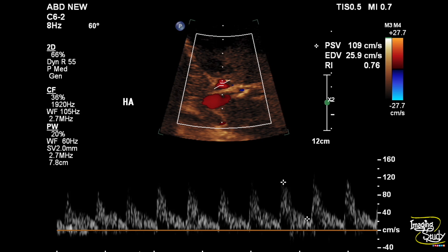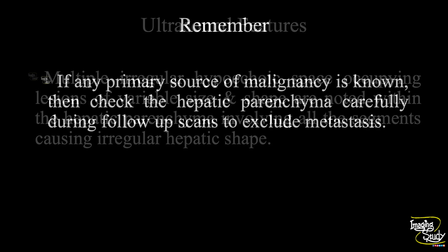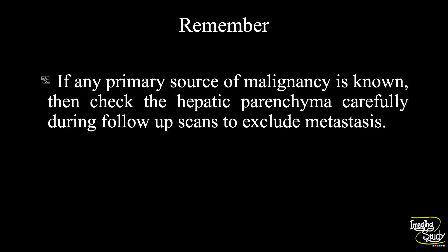So in summary, multiple irregular hypoechoic space-occupying lesions of different size and shape are noted within the hepatic parenchyma involving all segments, causing the hepatic shape to be irregular — indicating hepatic metastasis. The take-home message: if any primary source of malignancy is known, then check the hepatic parenchyma carefully during follow-up scans, if possible with high frequency, to exclude metastasis.